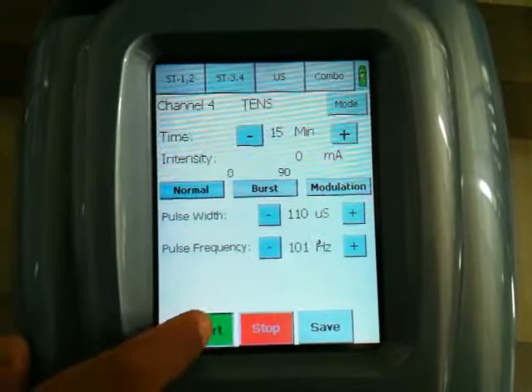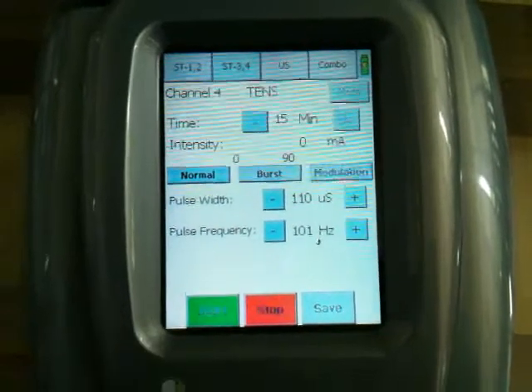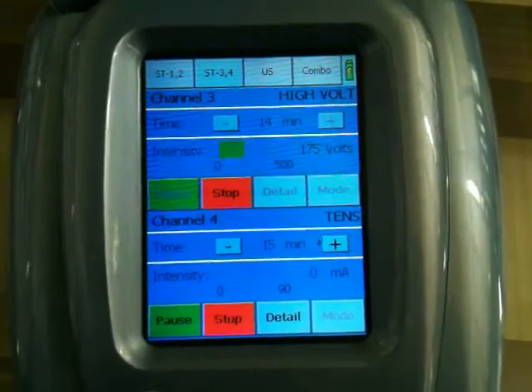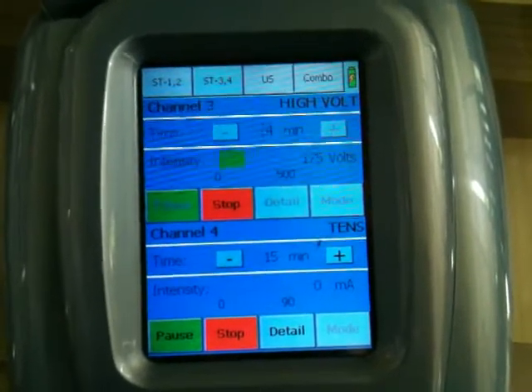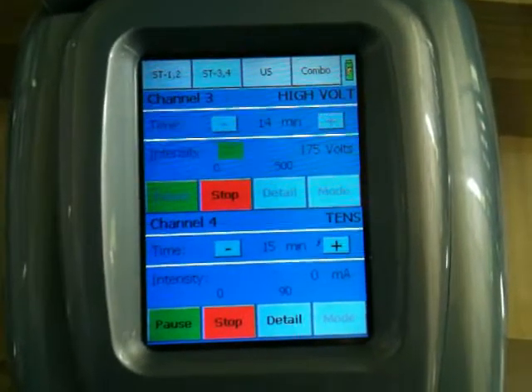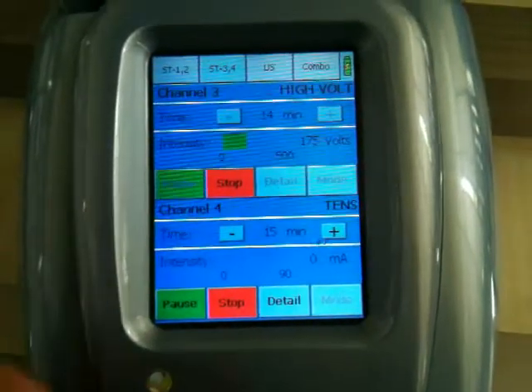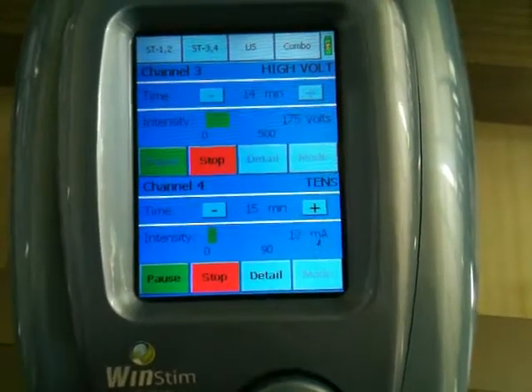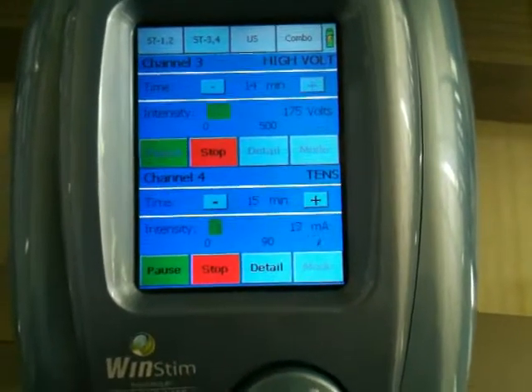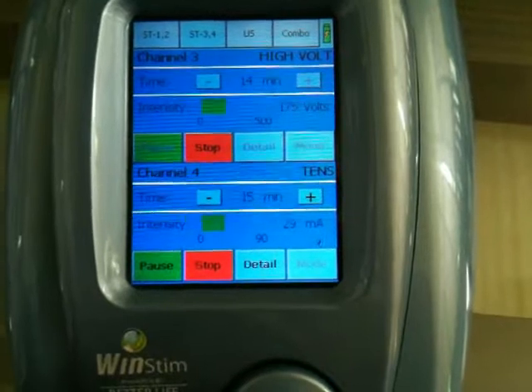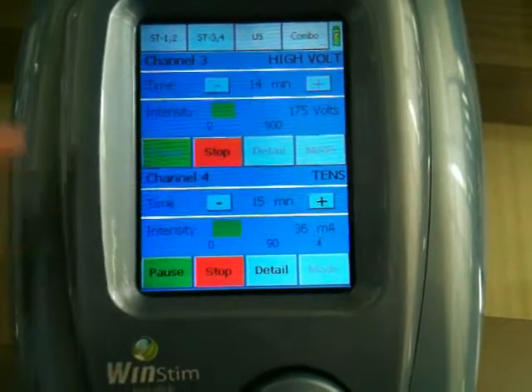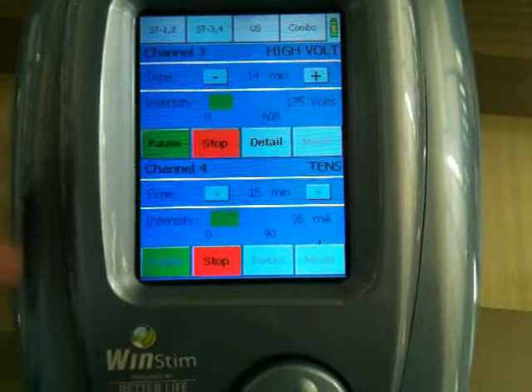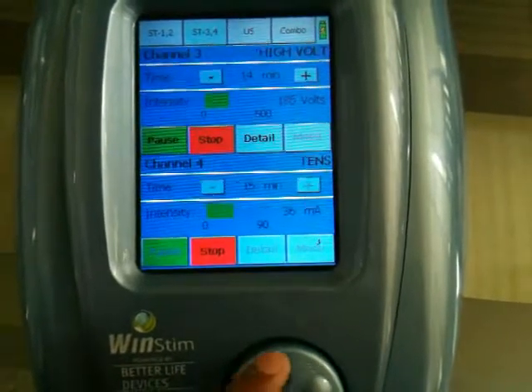Now let's start the treatment. You can see both windows have turned blue, showing both channels are active. If you want to increase the intensity in channel number 3, just tap on channel 3 and turn the intensity knob clockwise.